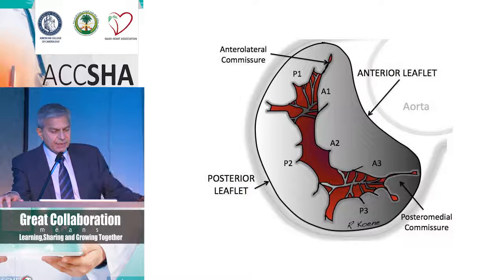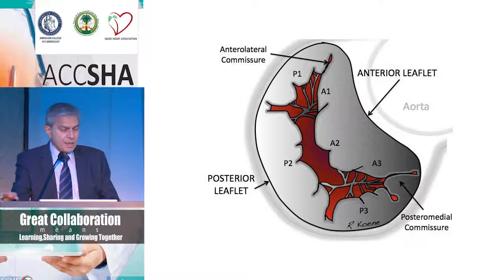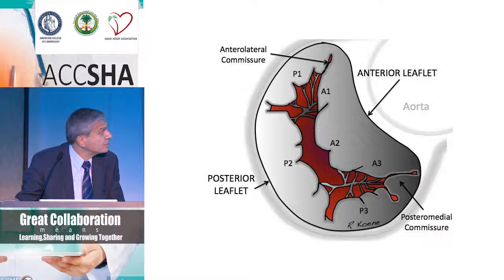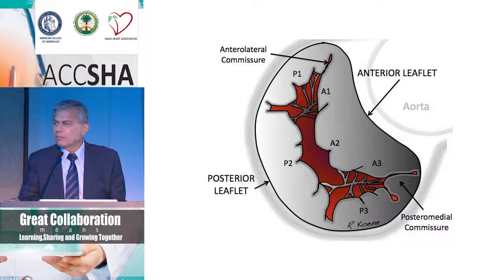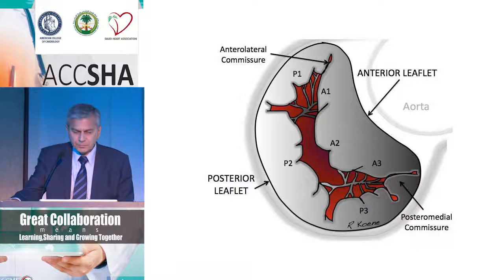So this is an example of what? This is an example of a very degenerative valve, also called primary or organic. You see that this is a very thick leaflet here, even a ruptured chordae right here. Okay? Do you see the mouse? Now we see it. So this is the ruptured chordae right there.